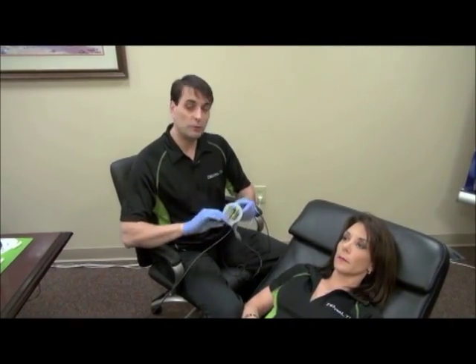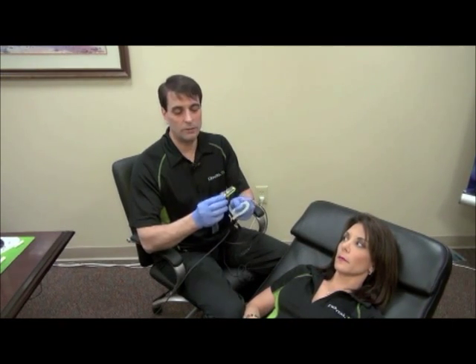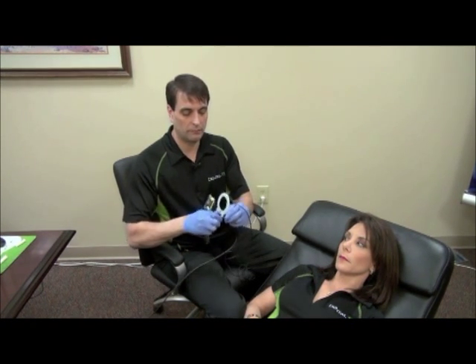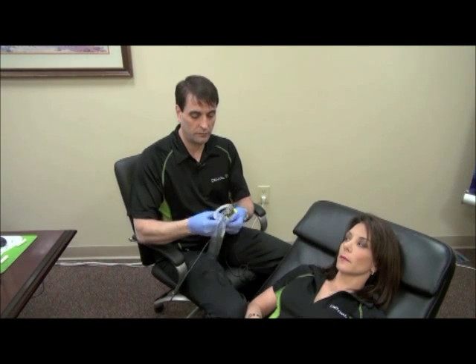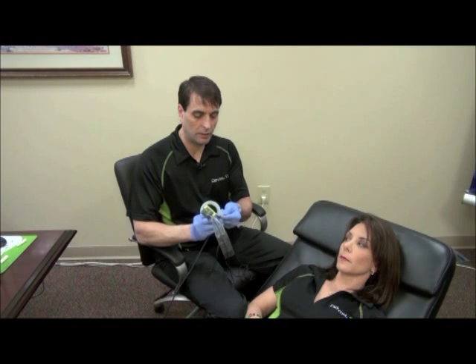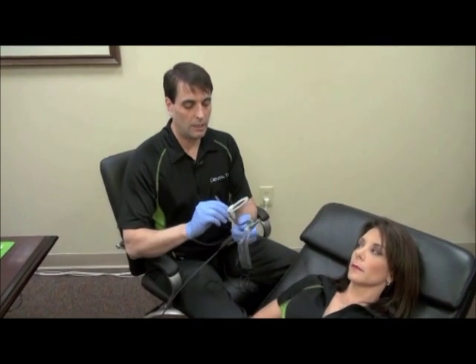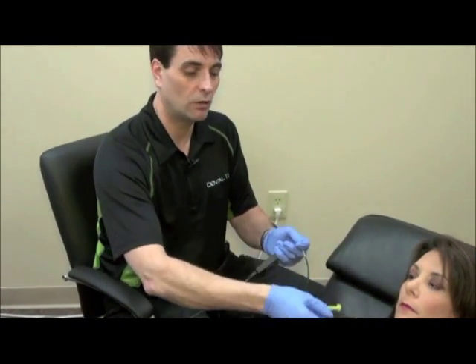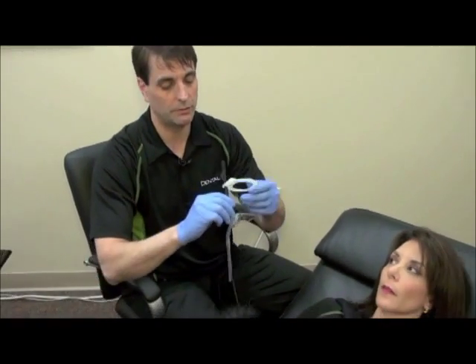The first holder we're going to talk about is the posterior PA holder — it's the Trollbike Camara. You'll notice it's yellow — that's the color coding. There's a detachable ring that fits on a little groove here for paralleling. This fits on the groove, locks into place, and you can pull it along that rail. This holder can take upper posterior PAs and lower posterior PAs. We're going to demonstrate taking the upper posterior PA.